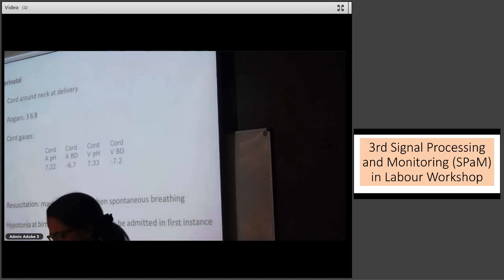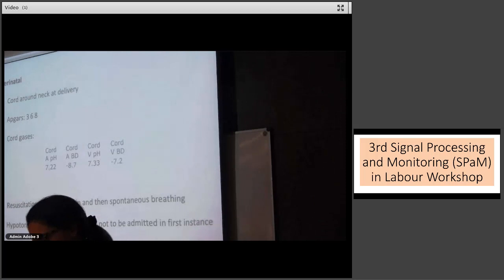The question is, if you look at that CTG, can you draw the same conclusion? And the literature is split down the middle. There's actually, you must know about this, a chap called Clapp that made this suggestion that it is possible to inflict those injuries without necessarily altering the gases. And that may be what we're dealing with.